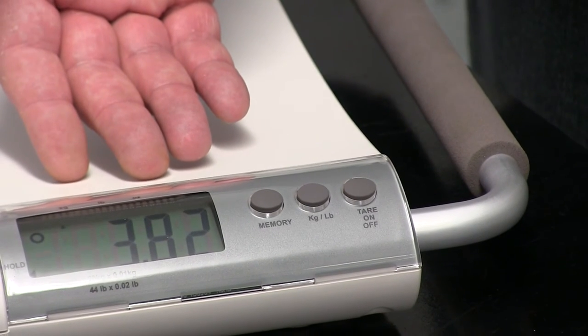The V20 also has an auto-hold function, meaning once you take Cheery off the scale, the weight remains there for you to make a note of.